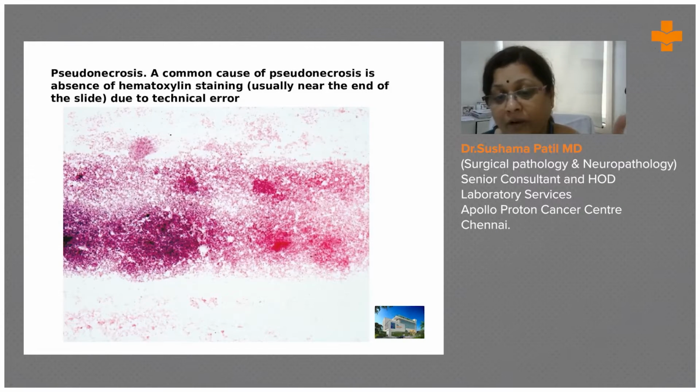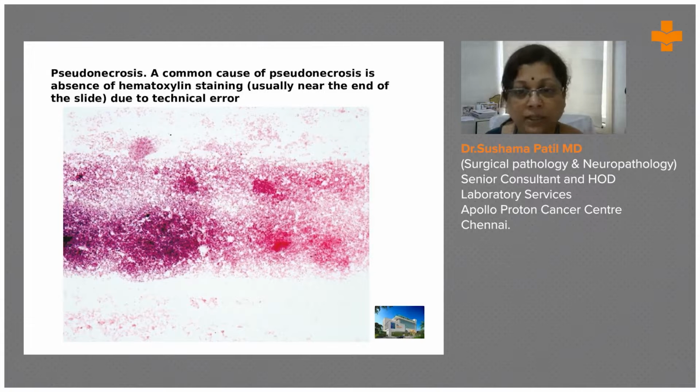So you have to be very cautious. Make sure the sections or smears are properly stained, and you go to an area where you can beautifully see the cells as a single dispersed film, and then make a call.